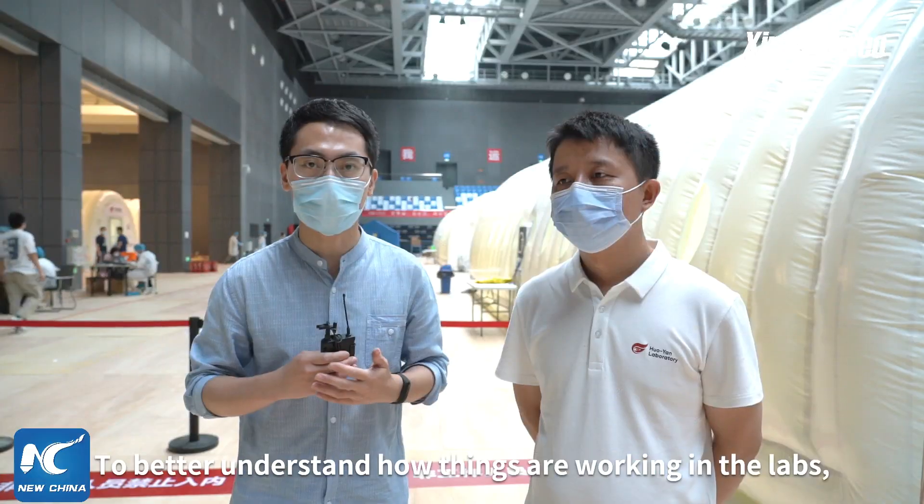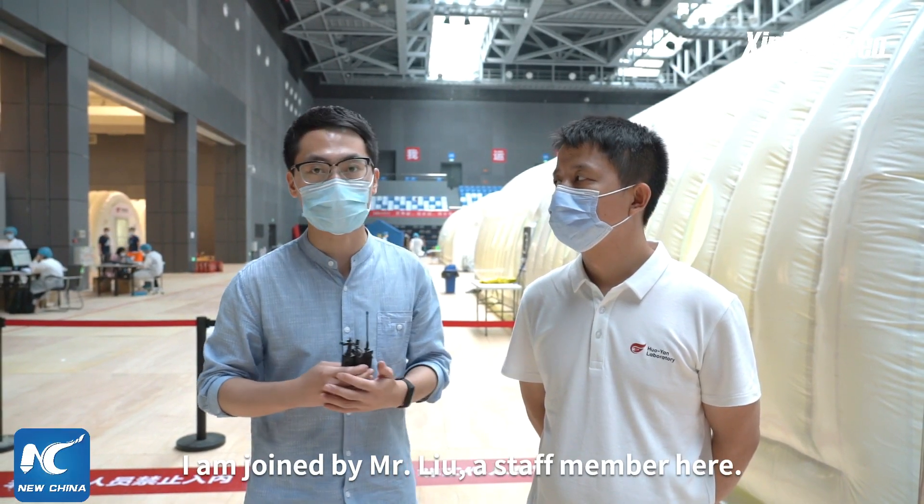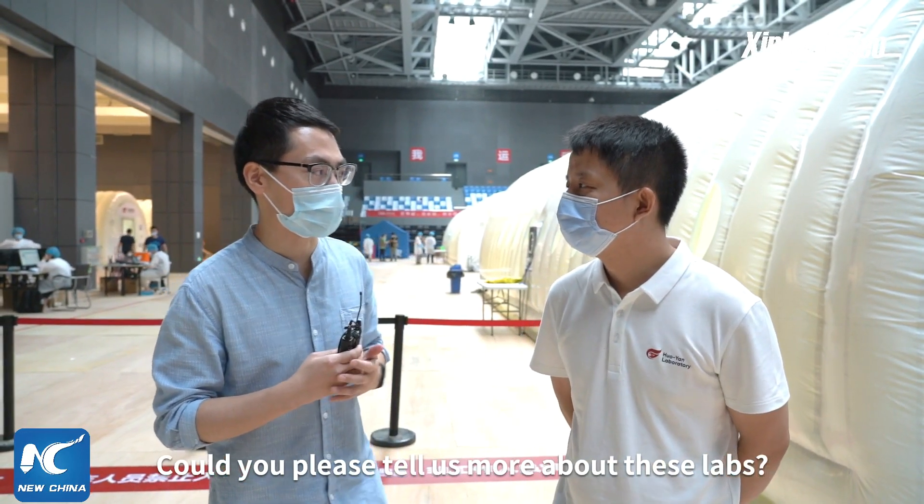To better understand how things are working in the labs, I'm joined by Mr. Liu, a staff member here. Liu, hello. Please introduce us to these labs.